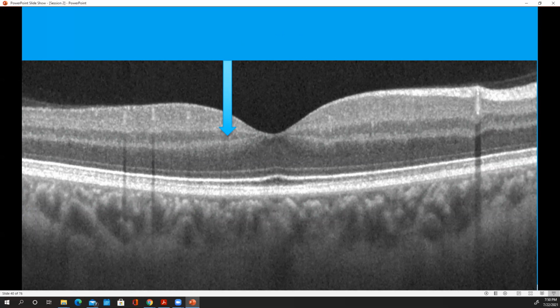You got it. That means it's nuclear. So that's an inner nuclear layer. You got it. Inner nuclear layer. Done. How about that one? That is the ganglion cell layer. You got it.